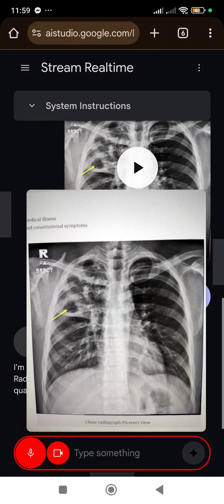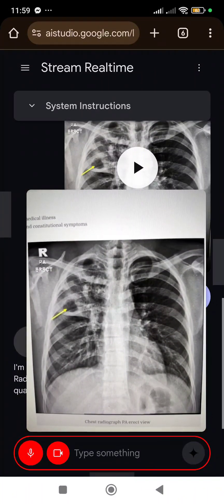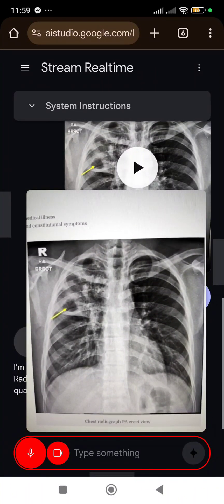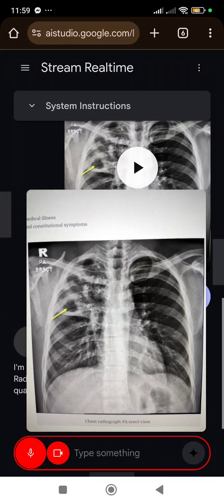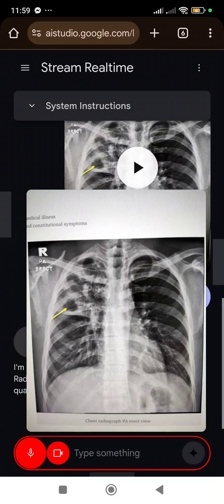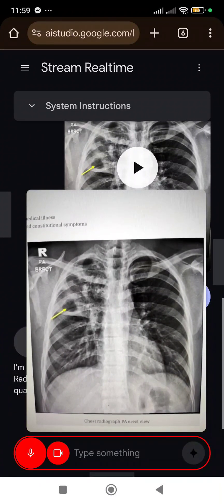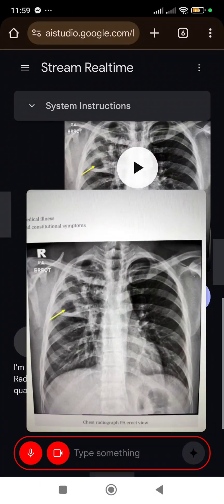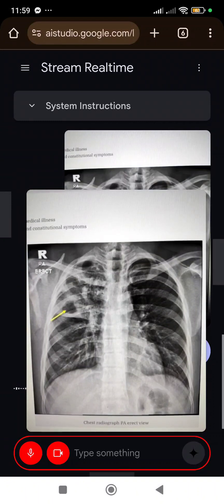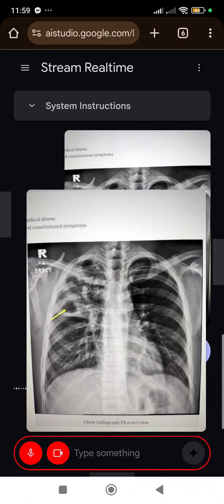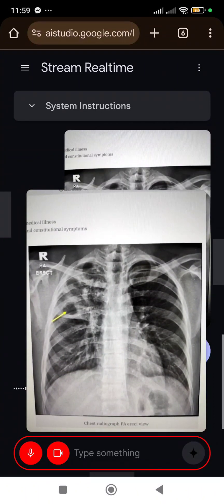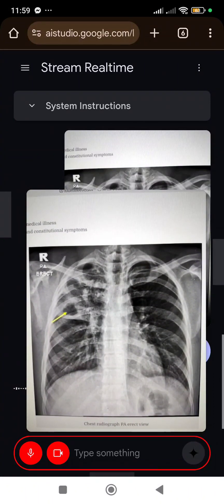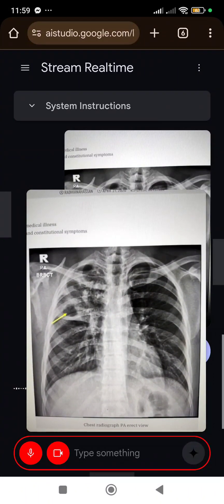I'm a radiologist. Pretend you're also a radiologist and tell me what you think the diagnosis is and make a report. Okay, I understand that you'd like me to pretend to be a radiologist and give a report on this chest x-ray.